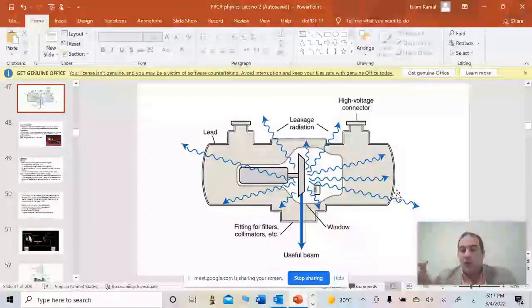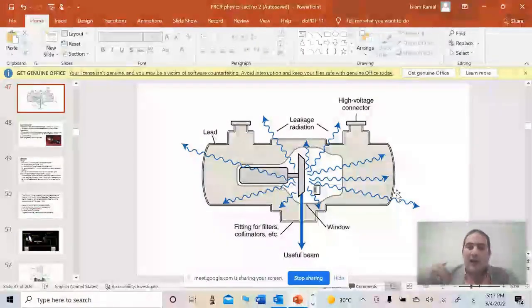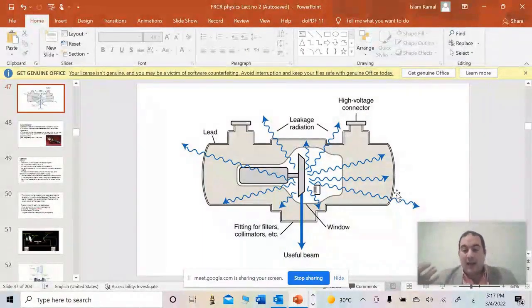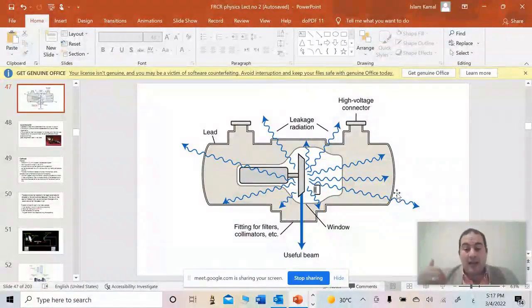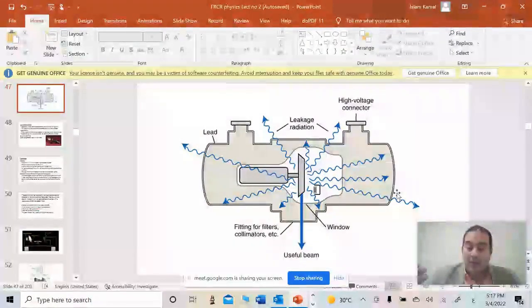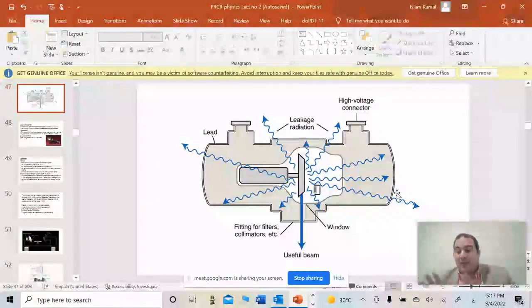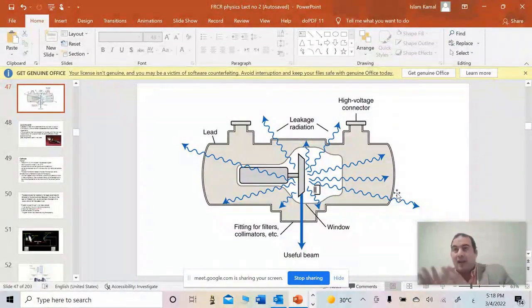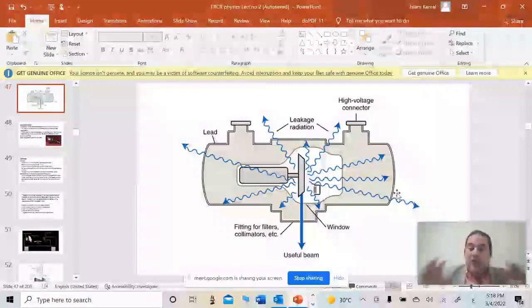Increasing the filament current will lead to an increase in the number of electrons obtained as a result of thermionic emission, because an increase in current generates higher heating, which facilitates thermionic emission and causes vibrations of the electrons on the surface. These electrons, which are formed at the filament, want to move from the cathode to the anode.